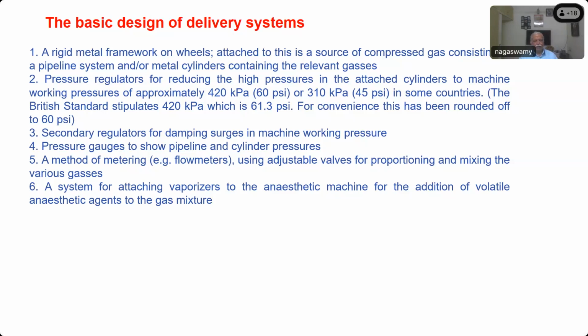And what is that system called? It is called Select-a-Tec. You select only one. You select a Tec vaporizer. What does the word Tec stand for? Temperature compensated. So TEC stands for temperature compensated vaporizer. So Select-a-Tec: you select a particular temperature compensated vaporizer and use only one at a time. That is the latest version of vaporizers.